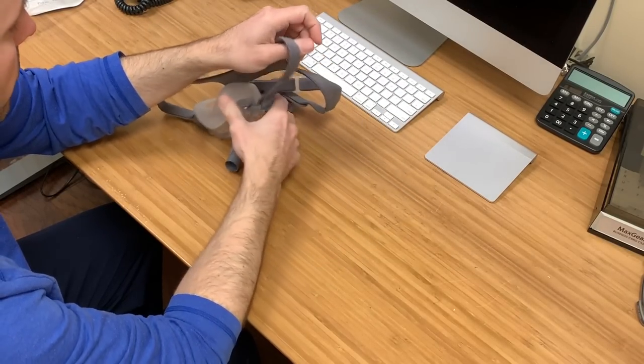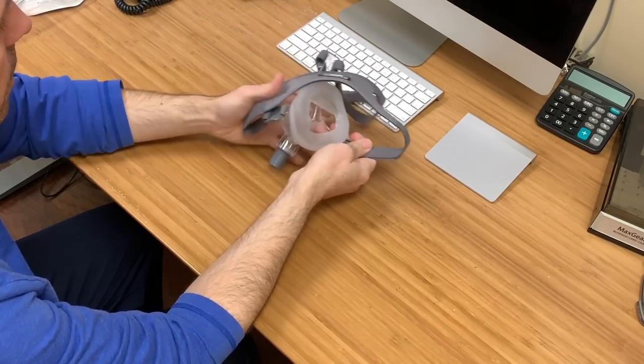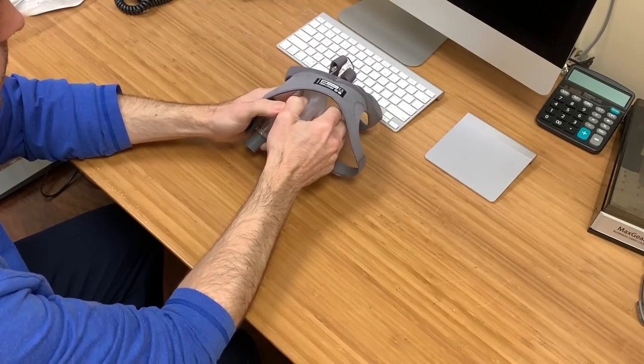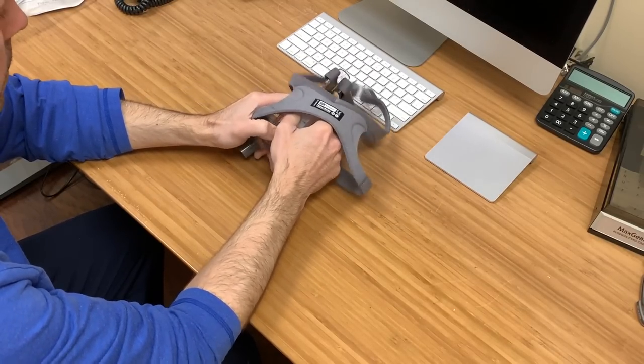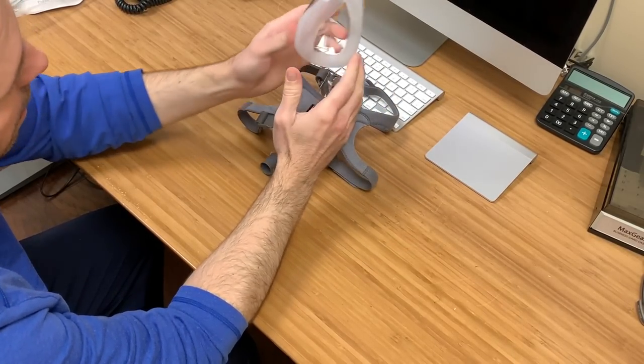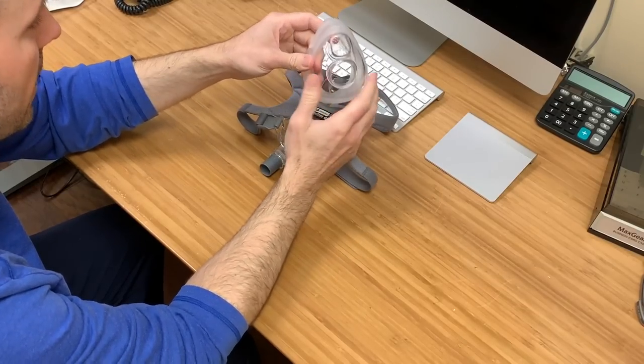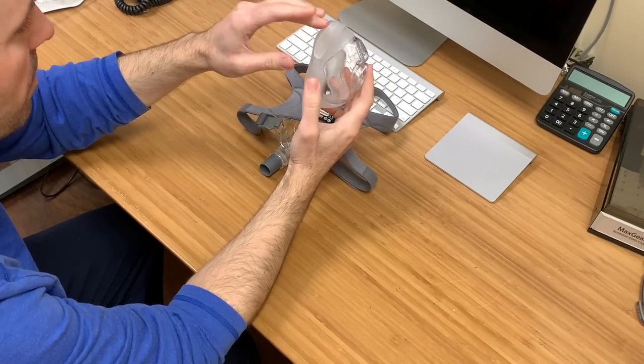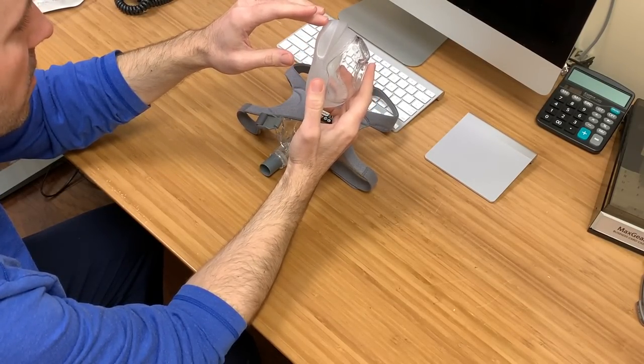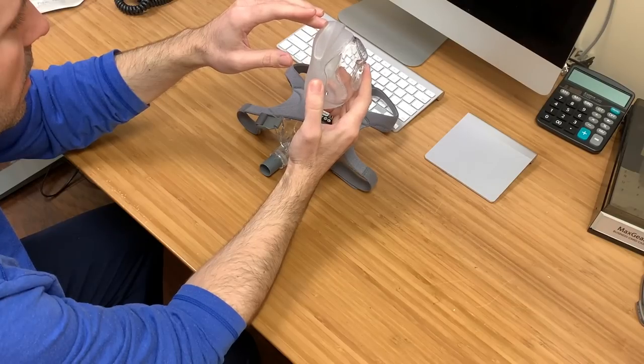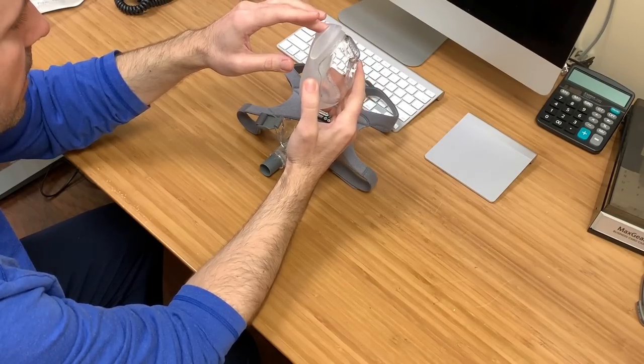The cushion, pull that off. Comes off just like any other manufacturer would. What's special about this is it's RollFit technology. It's spring-like there.